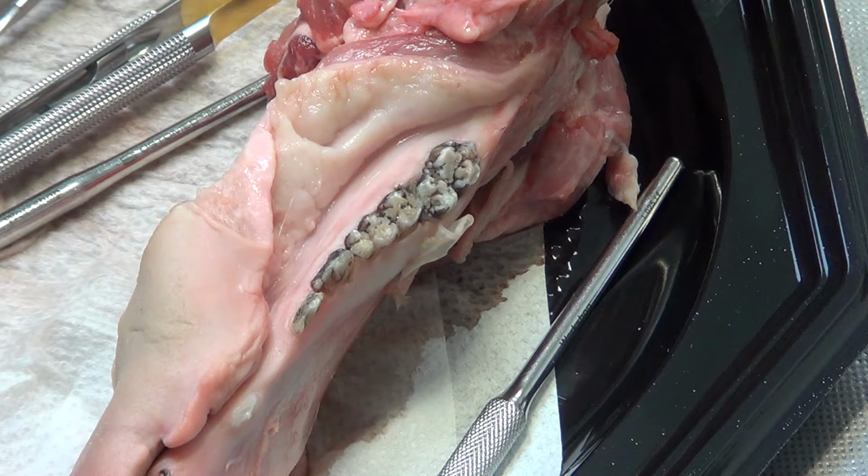If you are not able to go under the periosteum, you are not able to fix it. The suture moves with the mucosa and it's not correct. We need to go deeper. You can see perfectly there. You need to go deeper to go under the periosteum, and then when you close, you can pull down the mucosa.